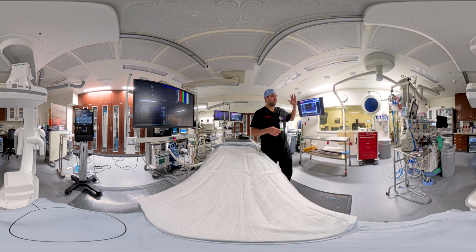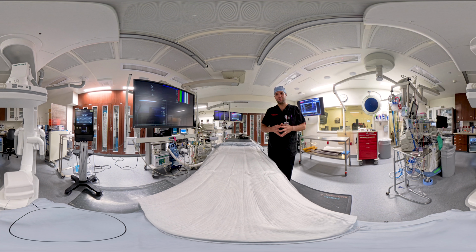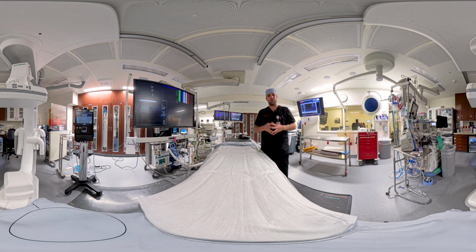I have 5 to 6 people helping me in this room to take care of everything, between nurses and technicians. I have nurses sitting back in the control room monitoring your vitals, and I have all the equipment that I need to perform this procedure. Once I'm done with the procedure, I'll go speak to your family or call them as you request, and I'll be able to see you after you're fully awake.